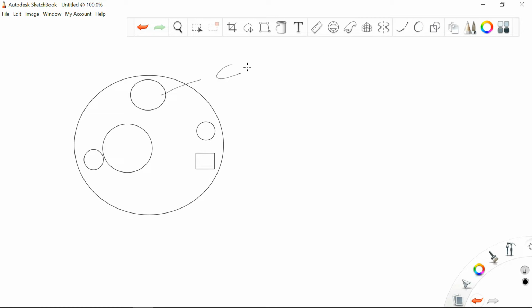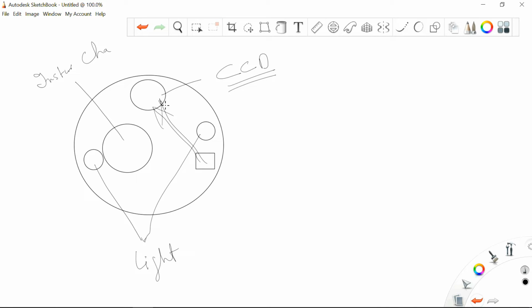This is the CCD. Nowadays it is also CMOS. The new concept of CCD is CMOS. This is the working channel, that is the instrument channel, through which you can put the instrument. And this is light number 1, light number 2. Turn the light on a little. This is the light. And here is the fluid ejecting knob. But the peculiarity is that the fluid is opening on the side, not at the tip.